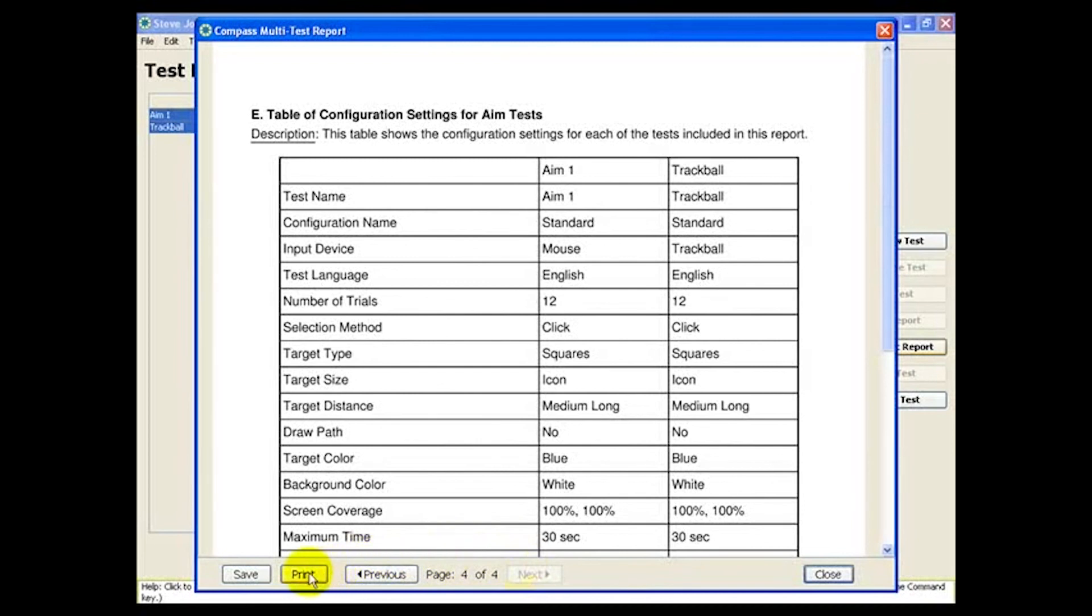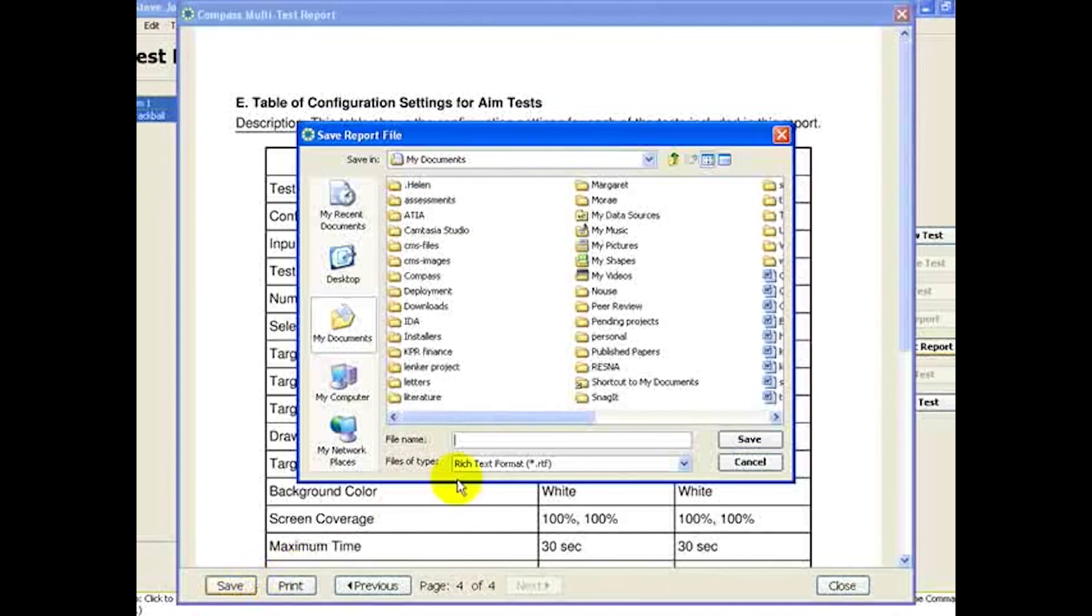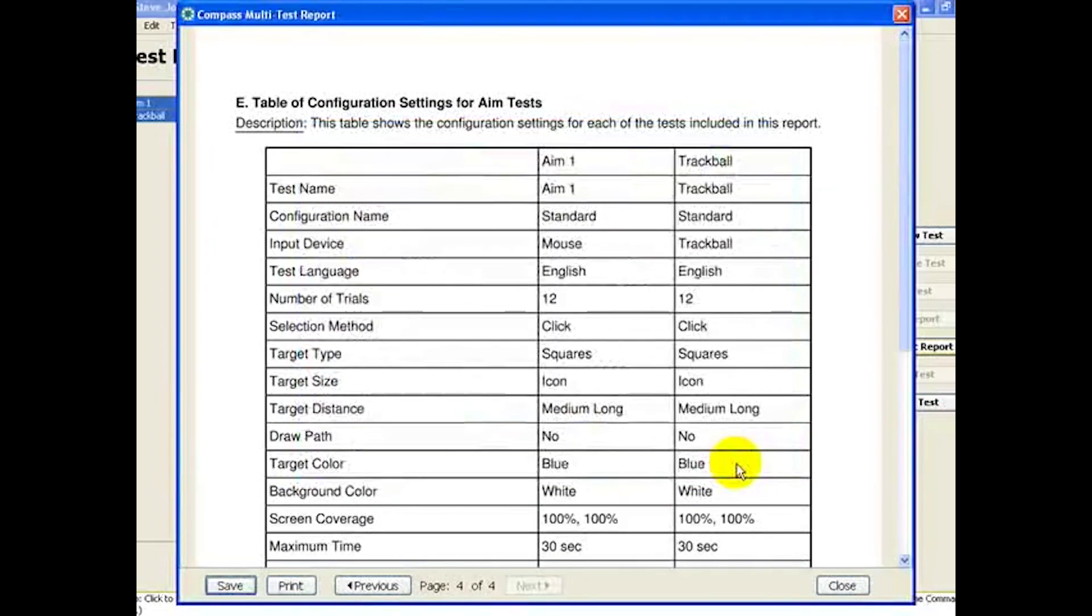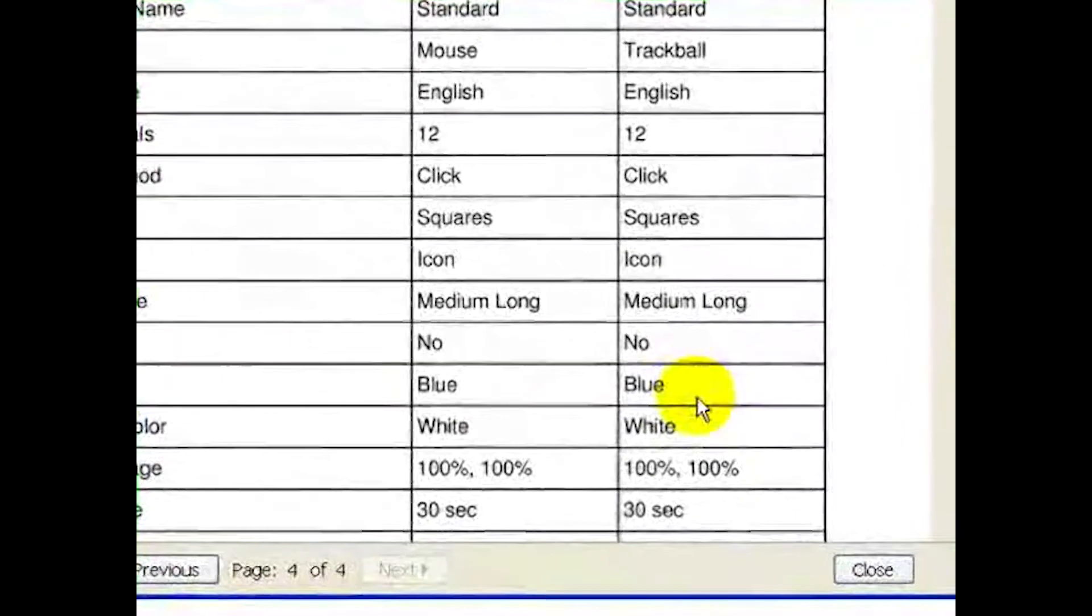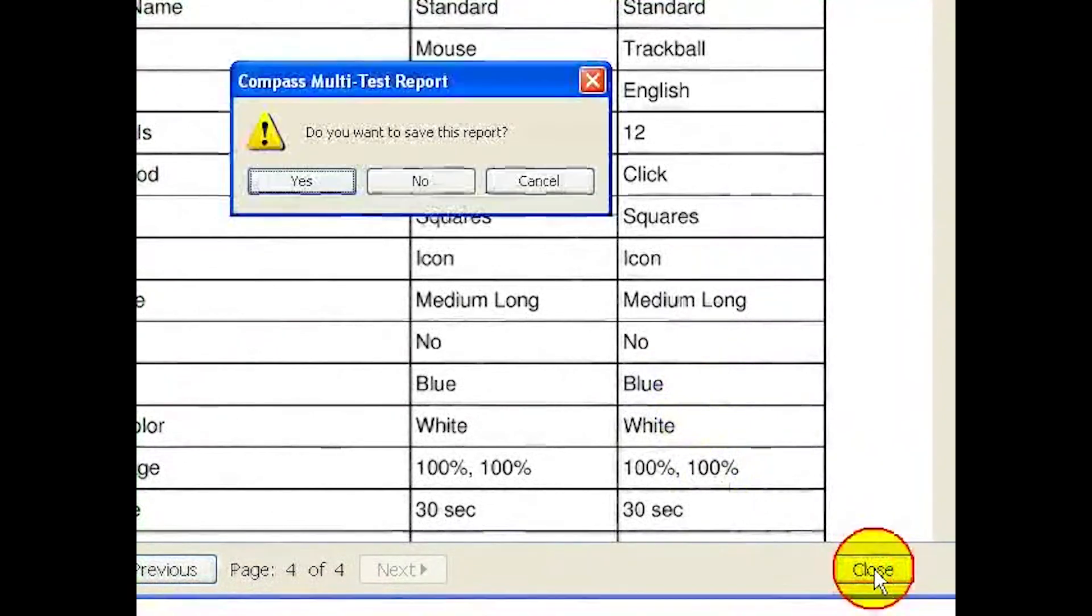You can print this report or save it in either RTF or PDF format. When you're done with the multitest report, just hit close.